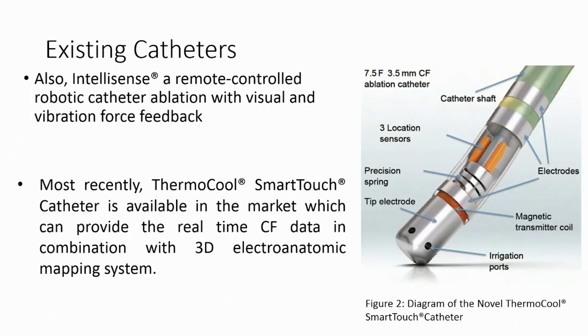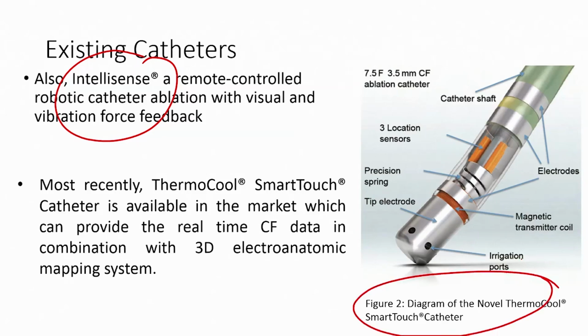Another catheter is the novel ThermoCool SmartTouch catheter. There is also a remote controlled robotic catheter ablation with visual and vibration force feedback, that is IntelliSense, but we are talking about the novel ThermoCool SmartTouch. Most recently this particular catheter is available in the market, which can provide real time contact force feedback in combination with a 3D electroanatomic mapping system.